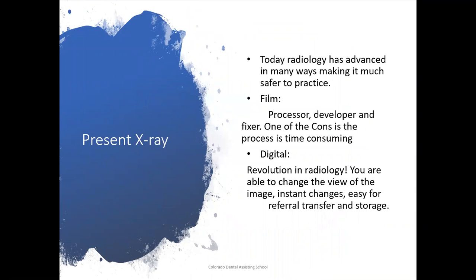Today, radiology has advanced in many ways, making it much safer to practice. I know a lot of you might be a little freaked out about the radiation that is involved in taking x-rays, but today we are going to learn about safety, how to keep yourself safe as dental assistants, and also how to keep your patients safe.